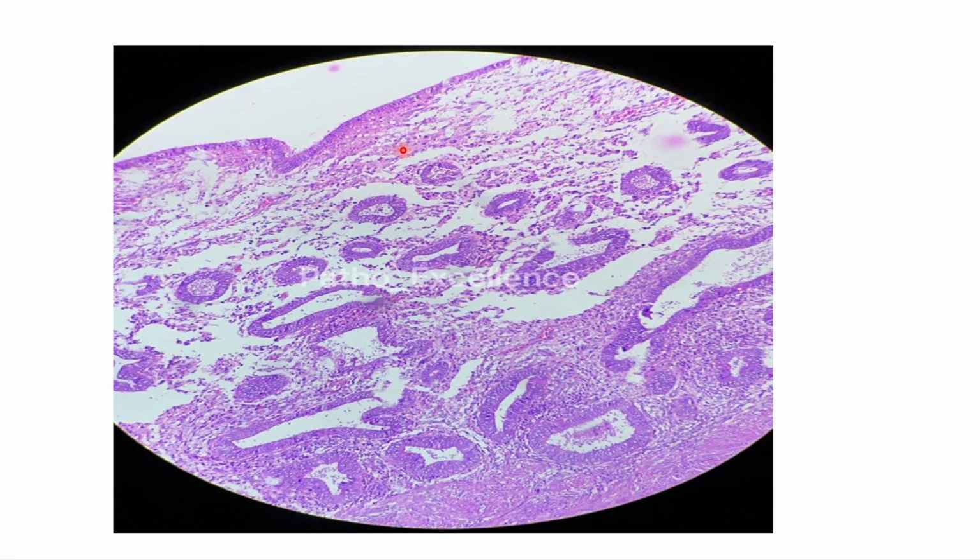Here you can see the stroma, which is very much edematous in nature, having fluid in between and a clear looking appearance of the stromal component in the presence of glands of endometrium. This is the basalis, this is the functional layer, this is the surface epithelium, and this is the edematous stroma.